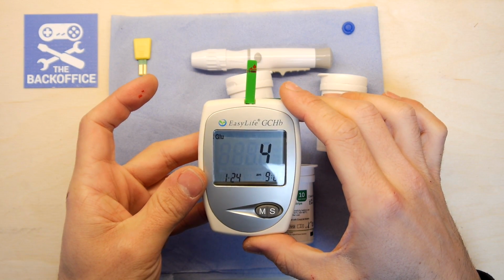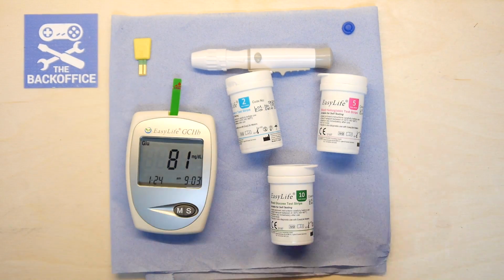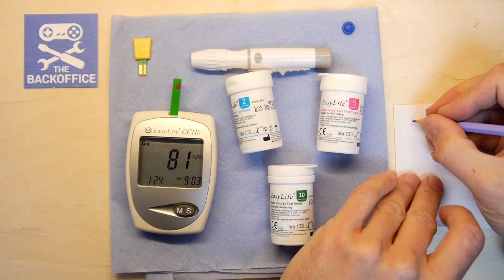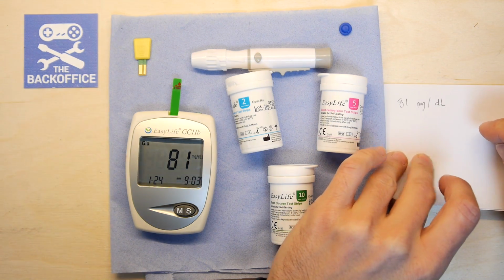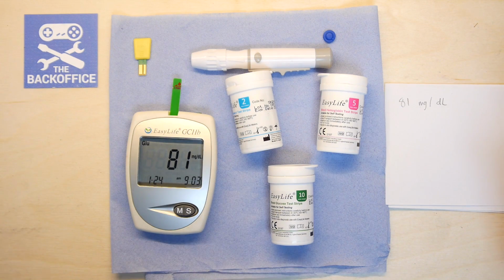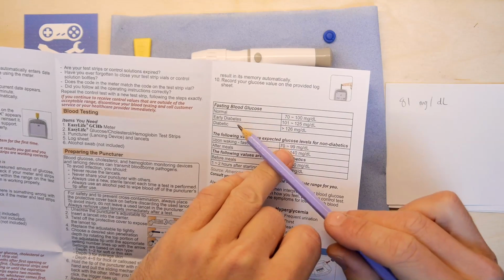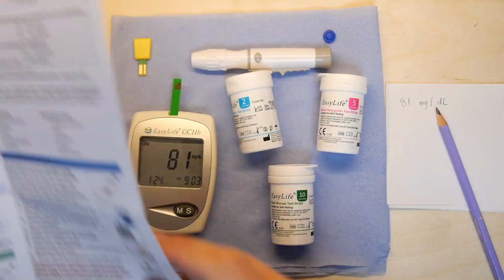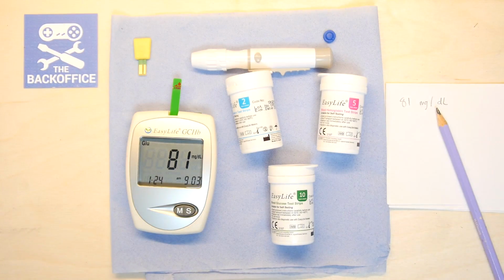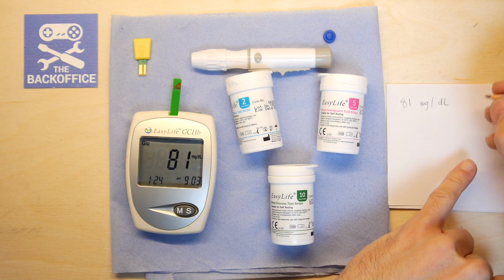6, 5, 4, 3, 2, 1. Yeah, baby, yeah! Is that good? Now, I think this is a different scale, because the other scale was an American one, which was slightly different. So I've got a chart here in front of me, which I shall try not to get blood on. It says fasting blood glucose normal 70 to 100, early diabetes 101 to 125, and diabetic over 126. So 81 milligrams. I think I'm doing pretty bloody well. There we go. That exercise has paid off, and I'm not going to die today, at least not because of my sugary blood. So I'm going to put that here, blood glucose.